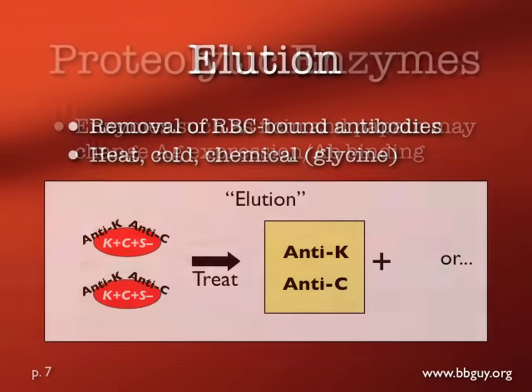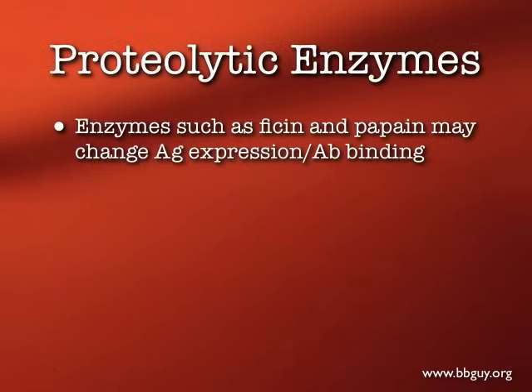Finally, proteolytic enzymes. We've talked about this in both of the preceding podcasts, but let me show you this illustration again because I really like it. Enzymes like ficin and papain cleave proteins. They're proteolytic.